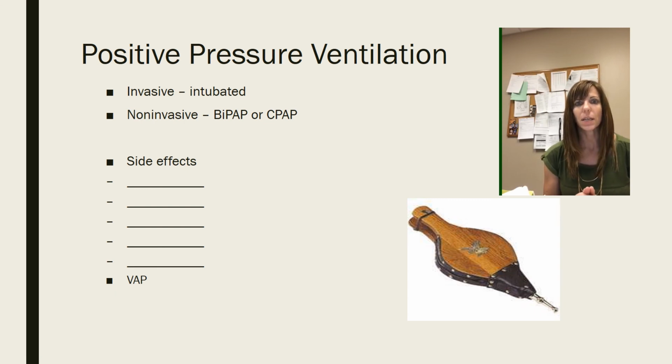And then the last thing, because we're going outside the body to inside the body with the endotracheal tube, infection is going to be a huge concern. And we look at VAP. That stands for ventilator-associated pneumonia. Anytime you put somebody on a ventilator, there's a risk of pneumonia. In my opinion, it should be called endotracheal tube-associated pneumonia because that's what's really causing the injury.